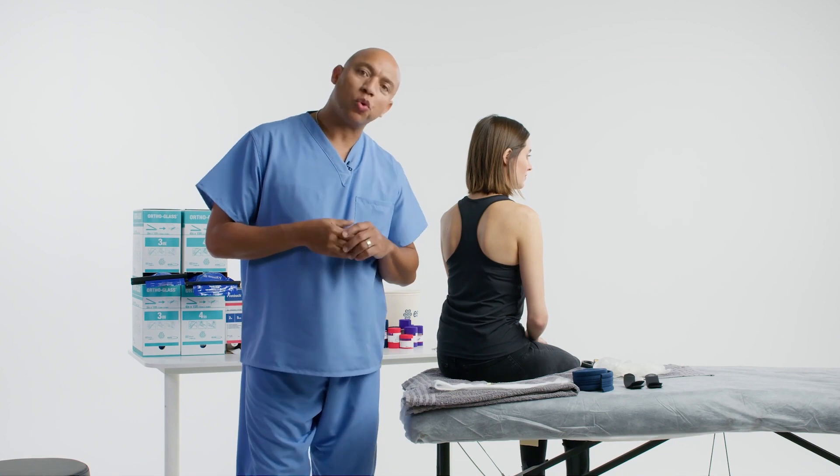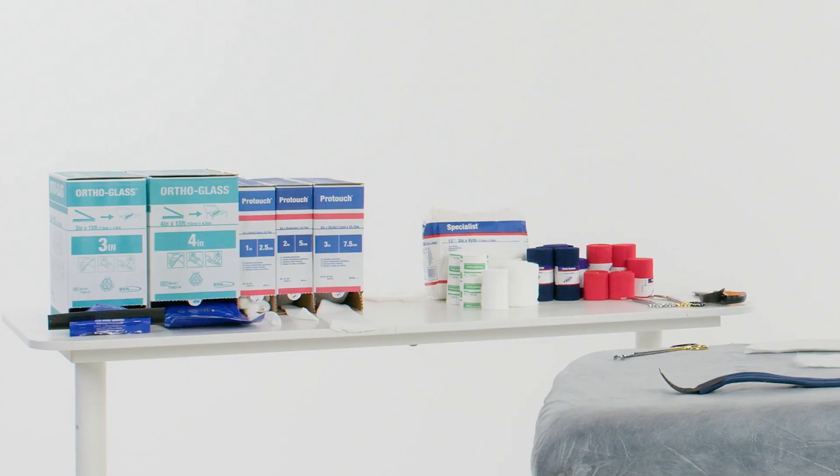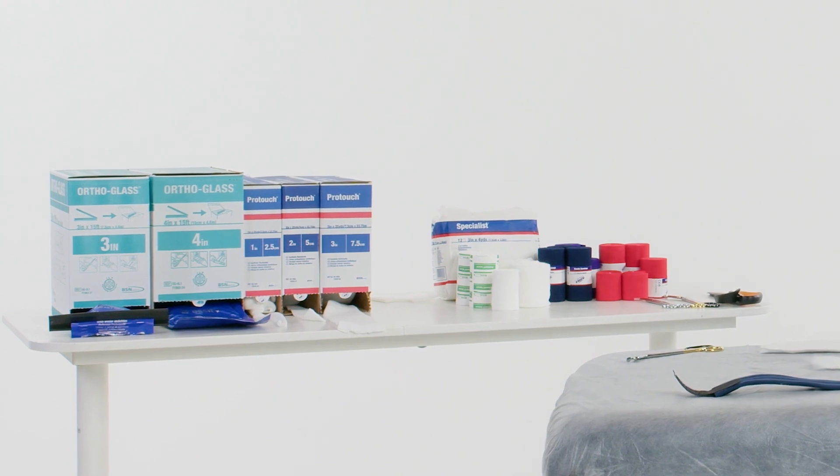Welcome to DeltaCast Tutorials. Today I'm going to be applying an ortho glass cooptation splint using sling on the roll.